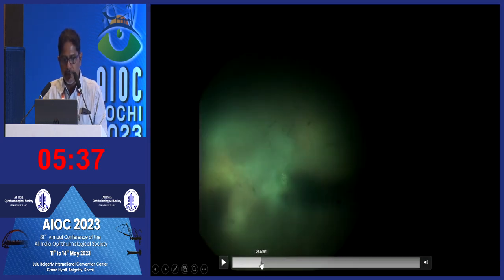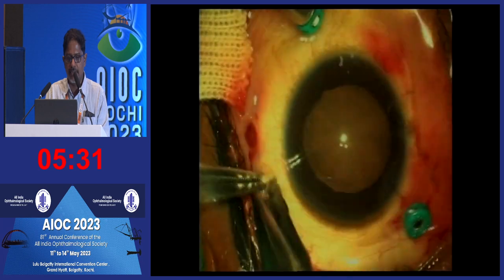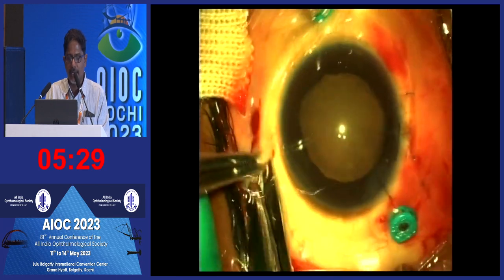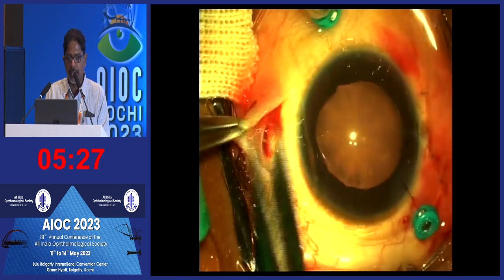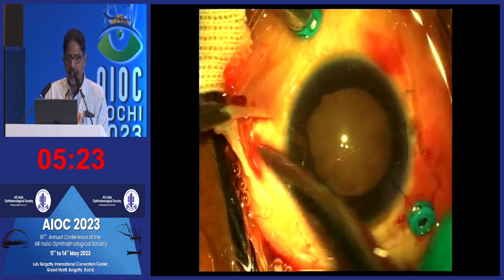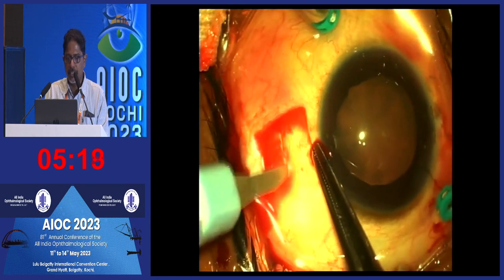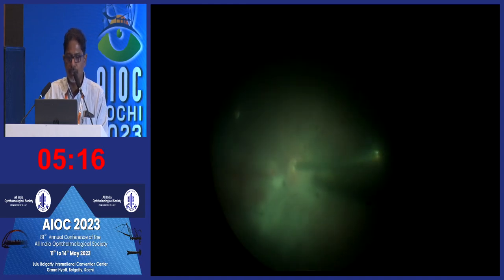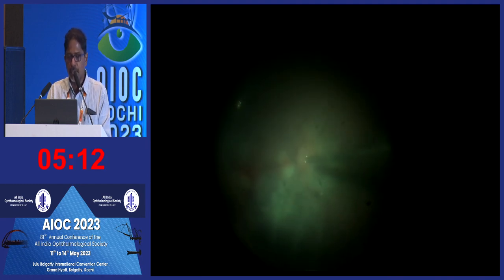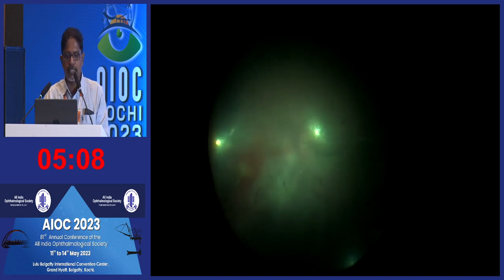That is the foreign body there, and you can see I have just lifted it from the retinal incarceration and freed it from the posterior adhesion. It is still anchored to the anterior scleral area. So I am trying to access it from the opposite side of entry. We are making a large sclerotomy there to avoid using the same entry point, because it is not easy to remove through an entry that is already sutured.